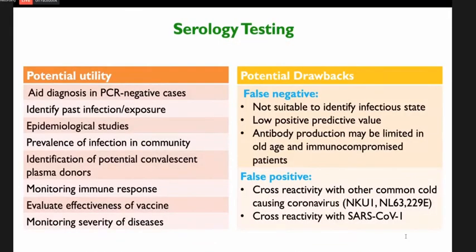Despite its limited use in the diagnosis, serological testing can be helpful in confirming suspected cases, especially in patients with milder or moderate illness or tested in the late phase of COVID-19 that are not detected by the molecular test.